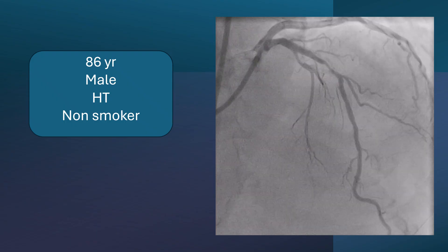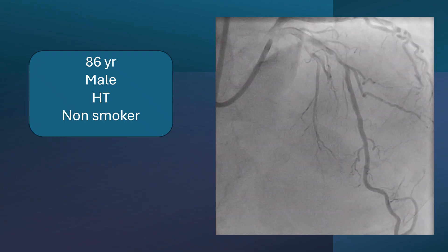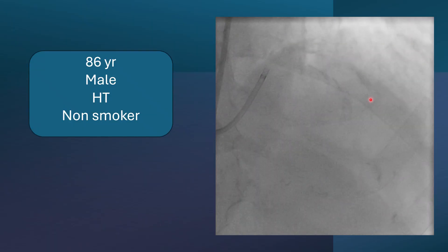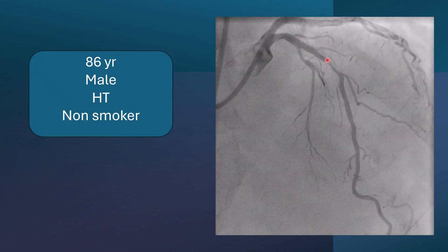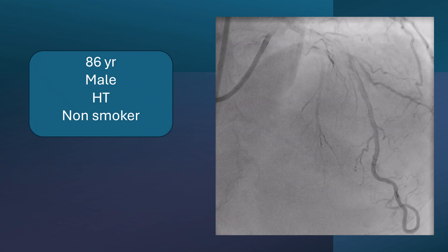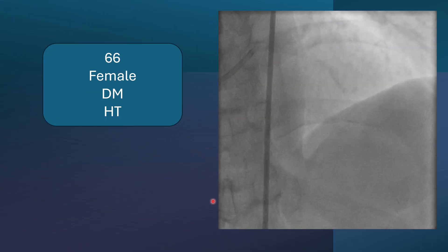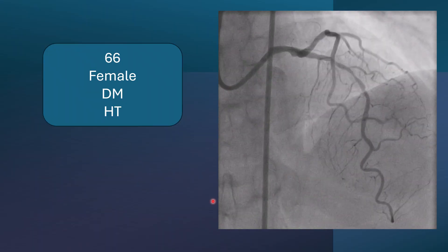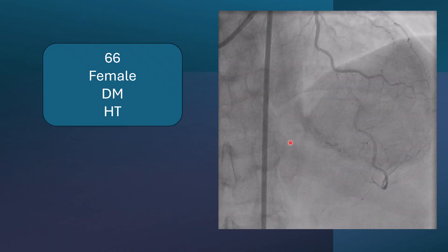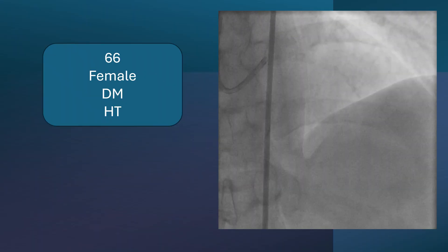The first case is an 86-year-old male who is hypertensive, non-smoker, and non-diabetic, with atrial fibrillation and angina on exertion. We can see a critical lesion at the mid part of the LAD, and calcification is evident before and after the lesion. The second case is a 66-year-old female who is diabetic and hypertensive, non-smoker, again with angina on exertion. The lesion may be longer in this case, but calcification is again evident on fluoroscopy.